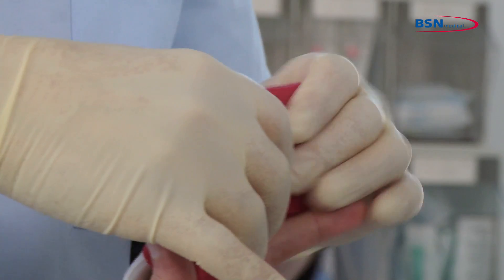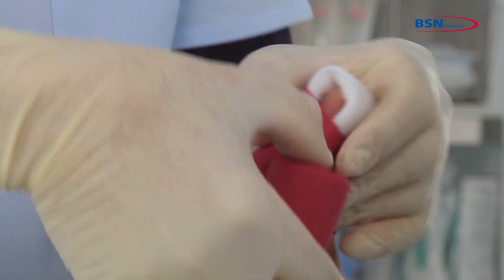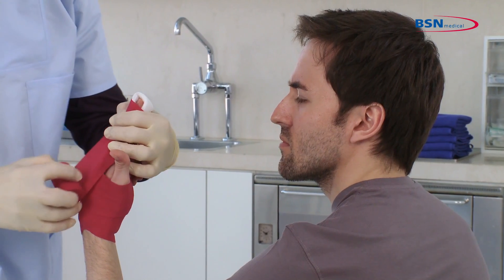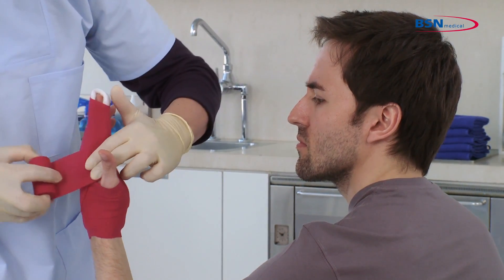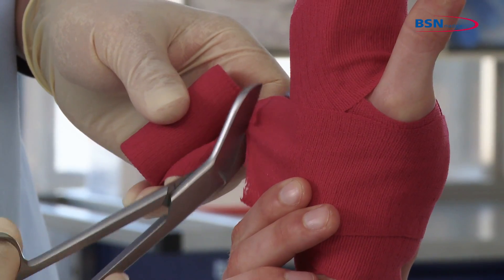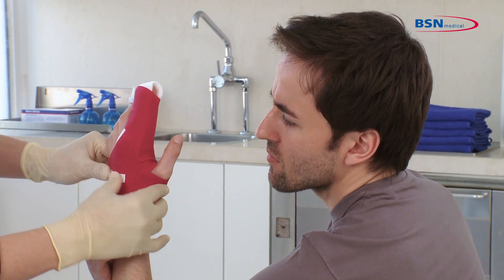Wrap around the injured finger twice and go down again through the web space. In the end, fixate the bandage at the patient's wrist with a tape or hook and loop fastener.